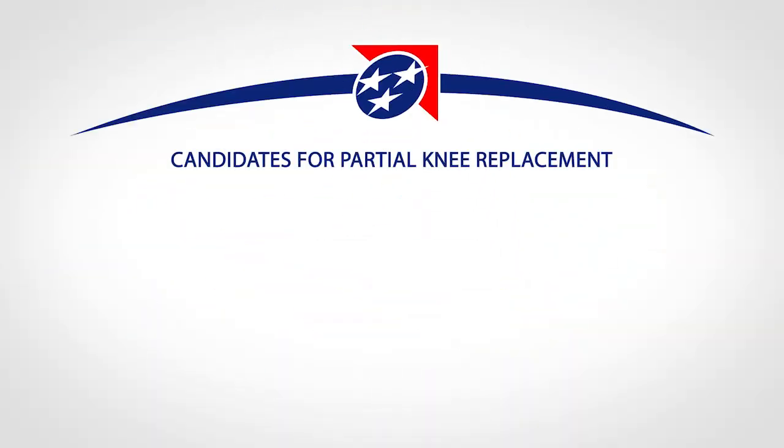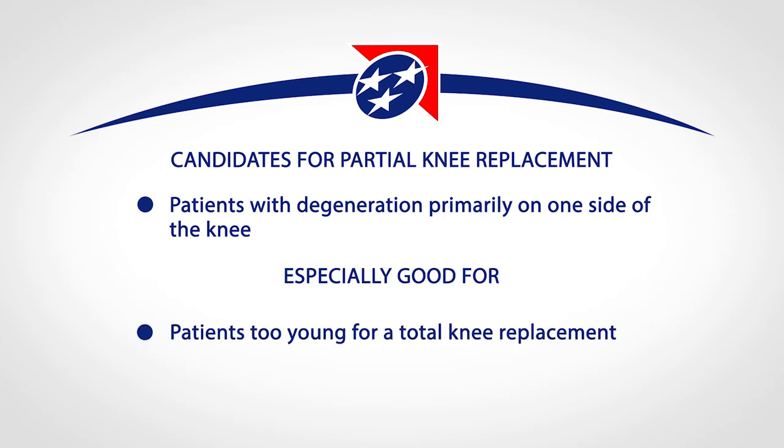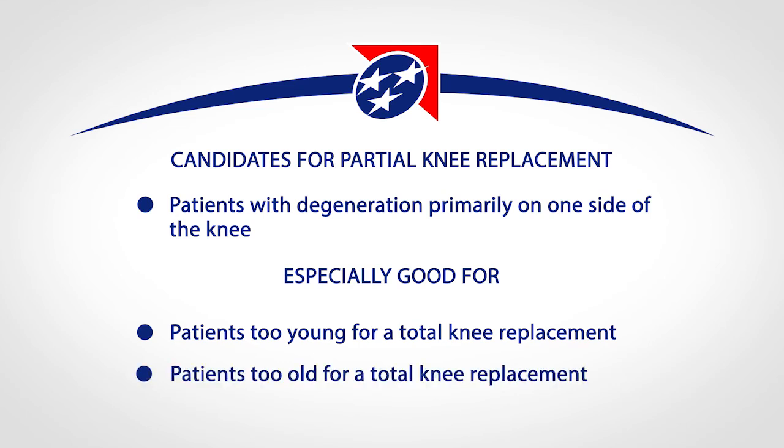Any patient with severe degeneration on one side of the knee can be a good candidate for partial knee resurfacing. The very young patient who's too young to have a total knee, in other words, whatever we do will wear out in their lifetime, is especially good for a partial knee because it's so easy to revise to another partial knee or a primary total knee. The older patients, by doing a partial knee, they'll never have to go through a total knee replacement, and it's so much safer and easier for them.